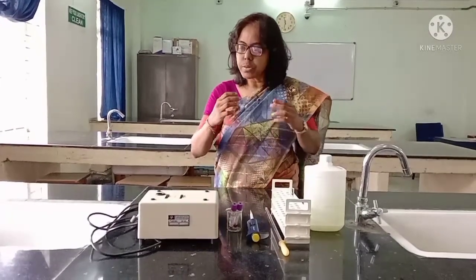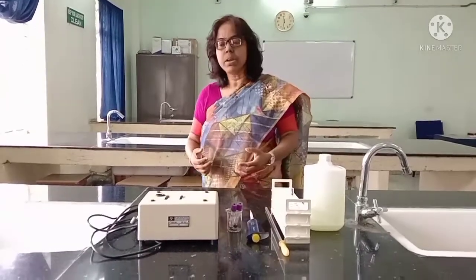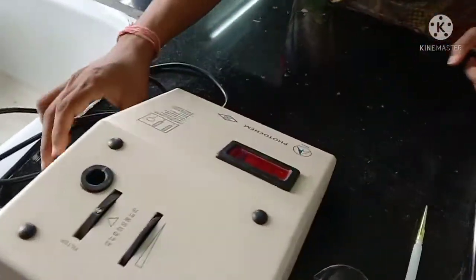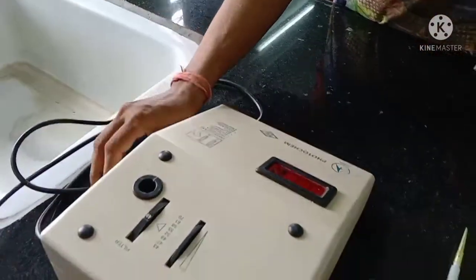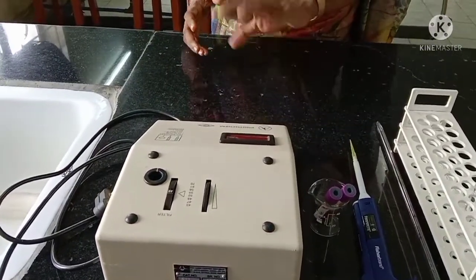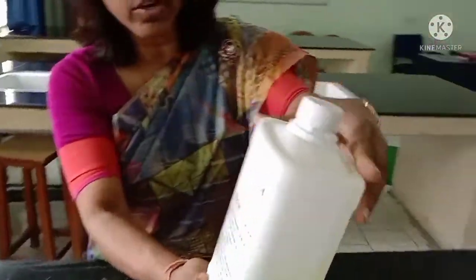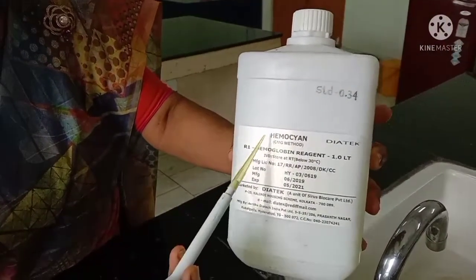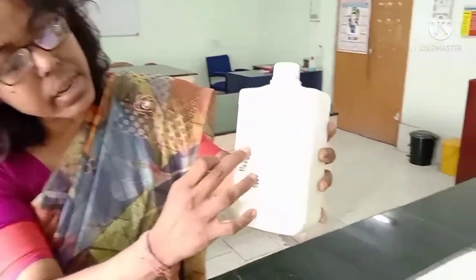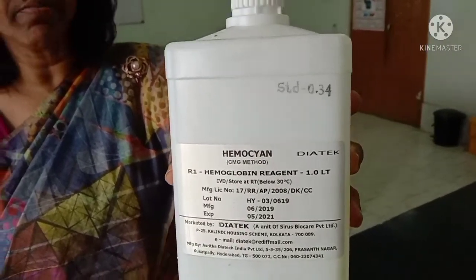First, I am going to demonstrate the materials used when we estimate hemoglobin by the cyanmethemoglobin method. First, you can see this machine — this is called a colorimeter. It is an electric machine with a plug. We will see how it works and how the calibration is set, including the green filter. The second material is the solution we are going to use. You can see it is labeled 'hemocyan' — it is commonly known as Drabkin's solution — and also labeled 'hemoglobin reagent,' meaning it is the reagent used for hemoglobin estimation by the cyan method.